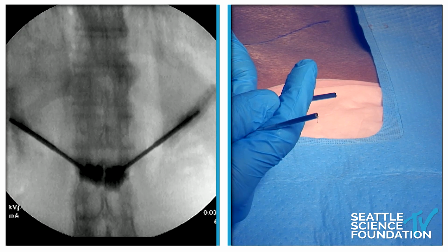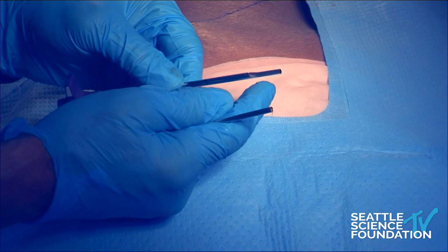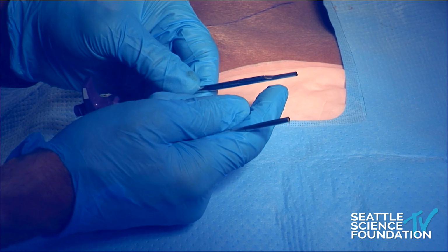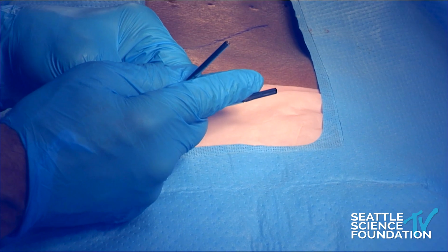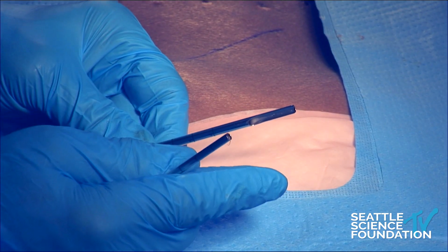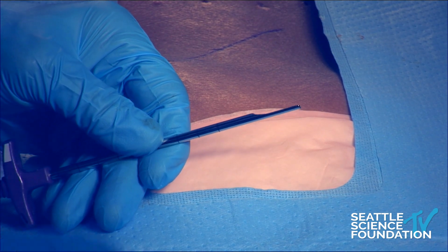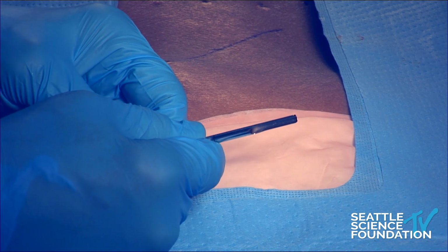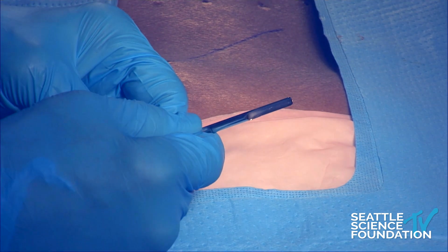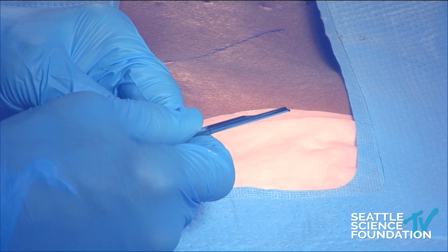If you have a superior end plate fracture, you aim it that way, and vice versa, whichever way you need it to go. If the balloon needs to go medial, you put the backstop wall of the cannula laterally, so it directs medially. This is called the Kyphon Assist. I'll rotate it around so you can see this directional capability of the balloon. This is definitely a nice advancement. This is a Medtronic device.